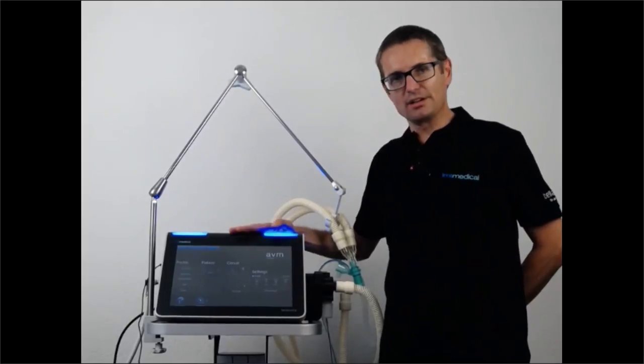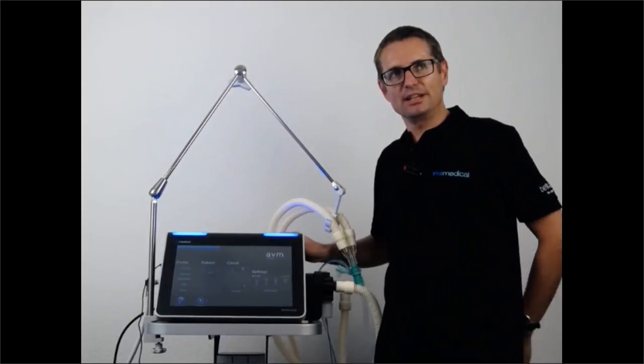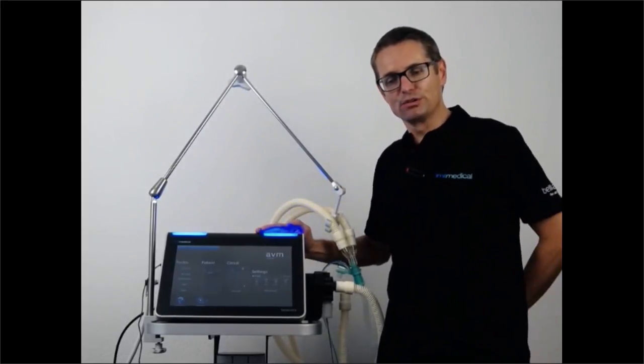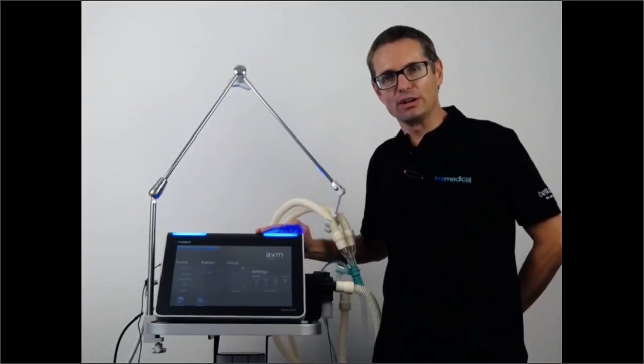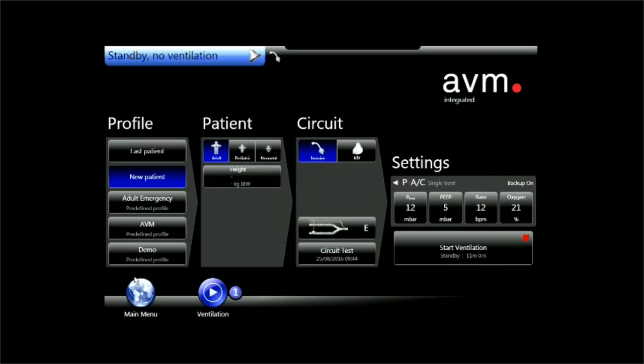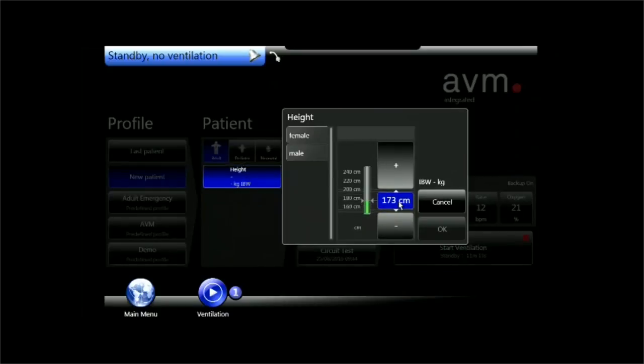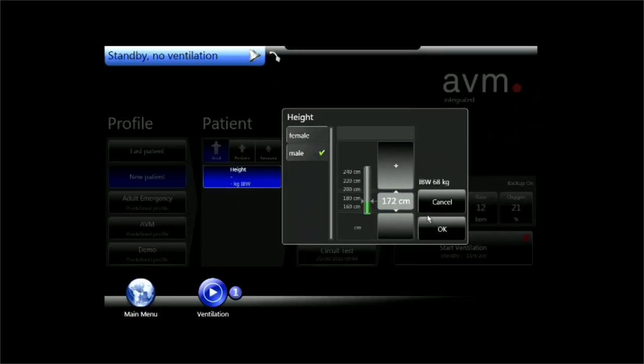It all starts at the start screen from Bella Vista, which we are going to look at now in more detail. When we set up a new patient via its height and gender, this not only sets the ventilation settings, but it also sets all the alarms.